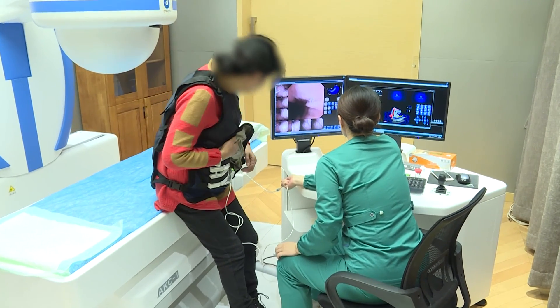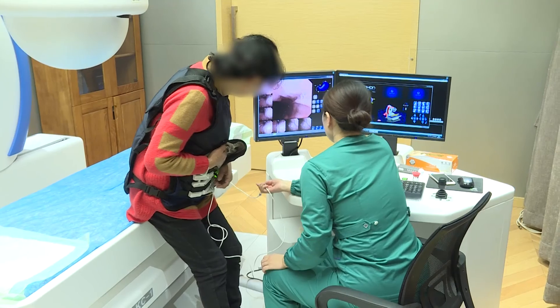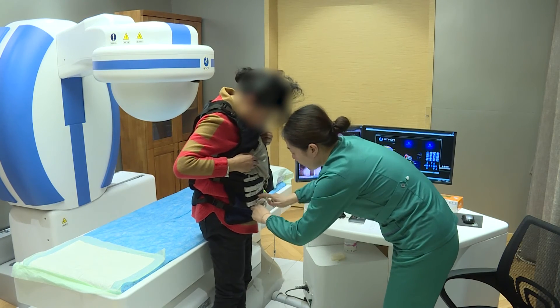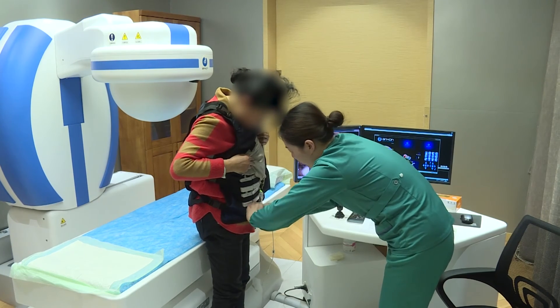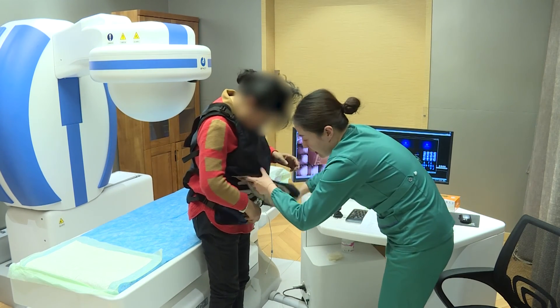If the patient required further examination of the small bowel after the capsule passed through the duodenum, the small intestine mode button under the real-time view interface was pressed. The patient was then allowed to leave the hospital with the data recorder for further collection of small intestine images.